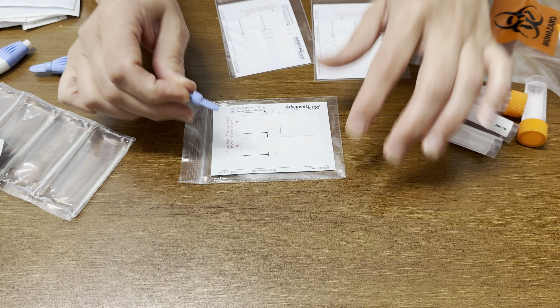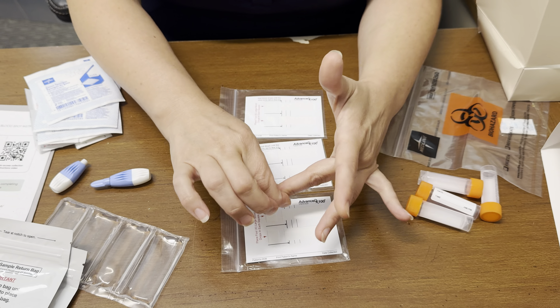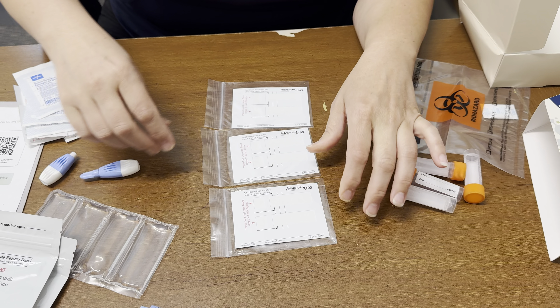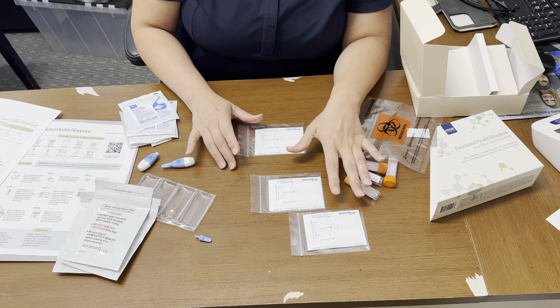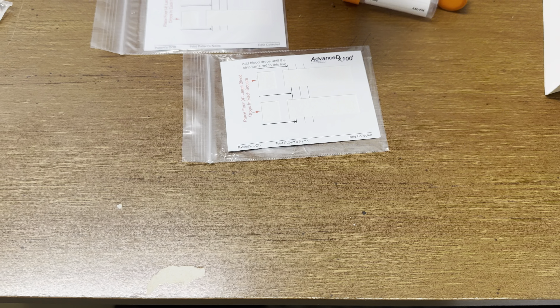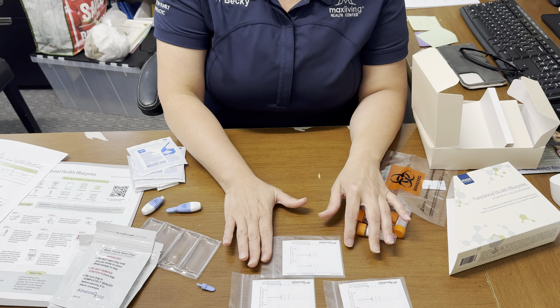Do that same procedure for all six squares. Occasionally you don't get enough blood to do all six — you can stop, clean it up, and try on another finger or another hand to finish the rest of them. Then leave these set to dry for 24 hours, open to the air. On the bottom of the card, fill in your date of birth, your name, and the date you collected it. Set them out on a table open to the air to dry and put a band-aid on your finger. That's how you collect the blood spot.